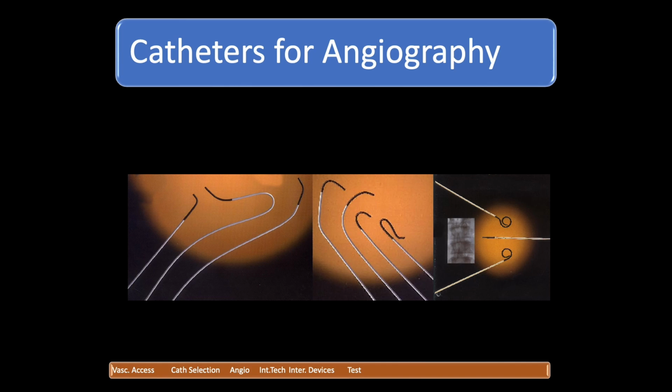The first one is used for carotid angiography and all. This one is for visceral catheters. It's called the Simmons curve. So Simmons curves you can use for visceral arteries, SMA, spinal arteries and all. These are all different things. Another one is a pigtail. Here the end is the pigtail curve, with multiple holes on the side. Otherwise, you have only one hole. At the other end, you have a connection for syringe.